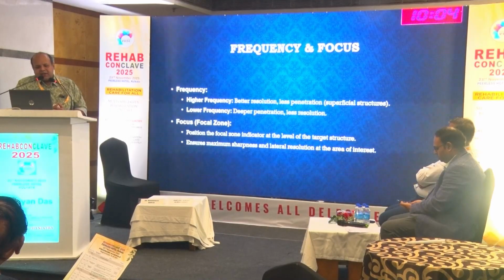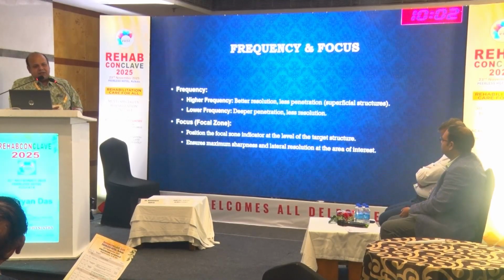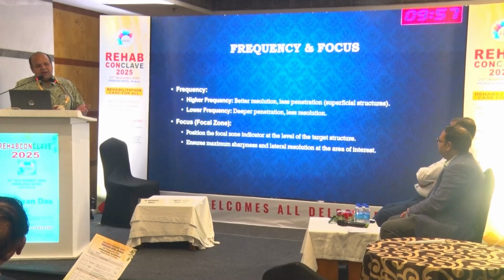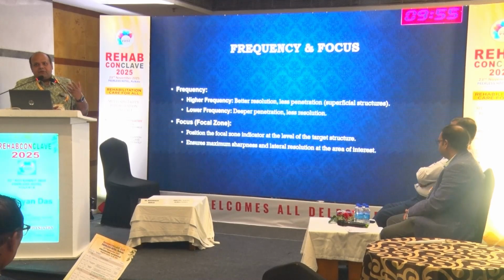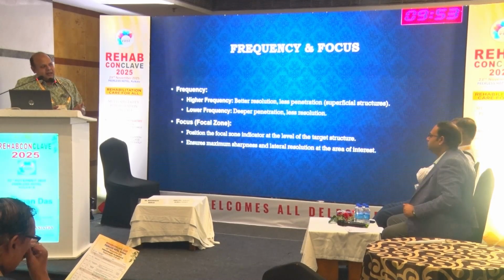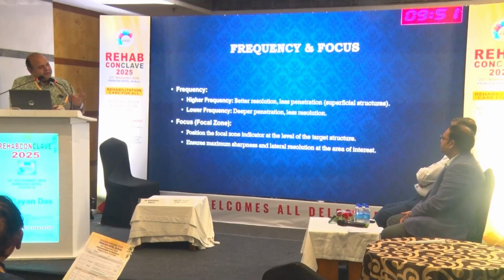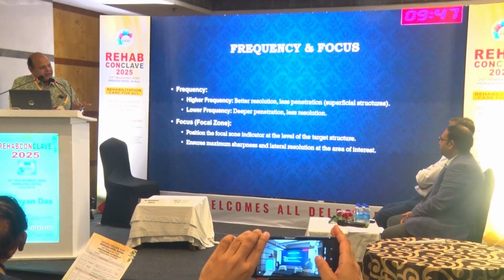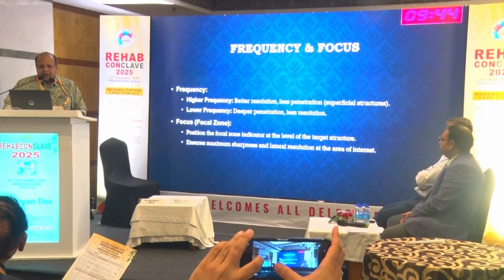The frequency and the focus for the better resolution, if you want penetration, as I already said, you reduce the frequency. This probe 418, what does it mean? It is capable of producing 4 megahertz to 18 megahertz. Depending upon your need, you can manipulate it.